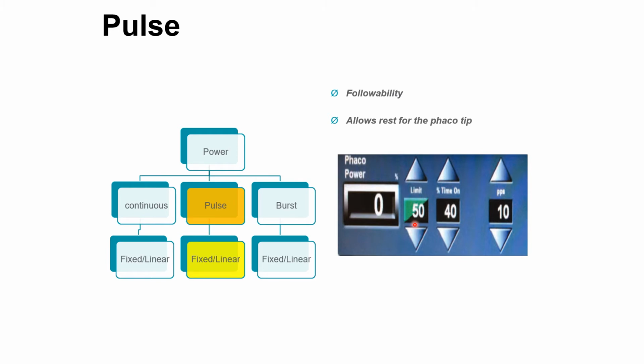So if your Phaco tip total stroke length is 100 microns, and you have selected 50% at the end of foot switch position 3, that is 50 microns. So when you press the foot switch, go deeper inside foot switch position 3, and touch the bottom of foot switch position 3, you get 50 microns of stroke length.